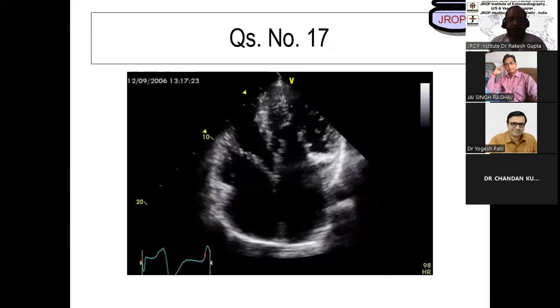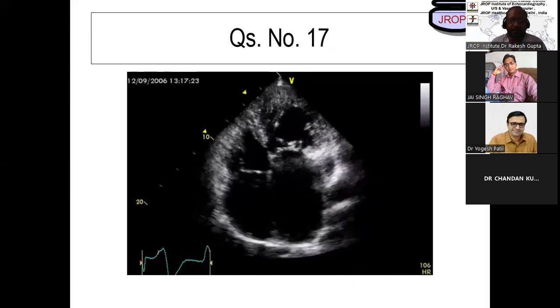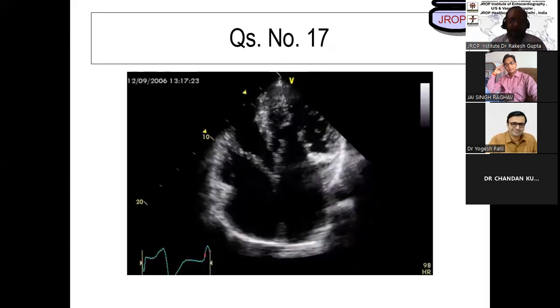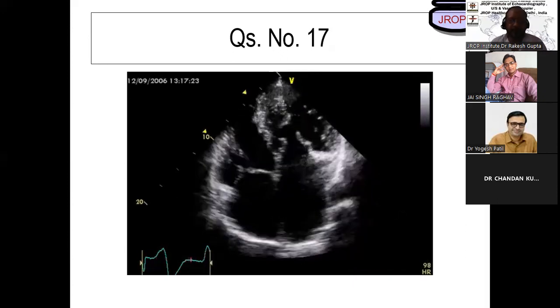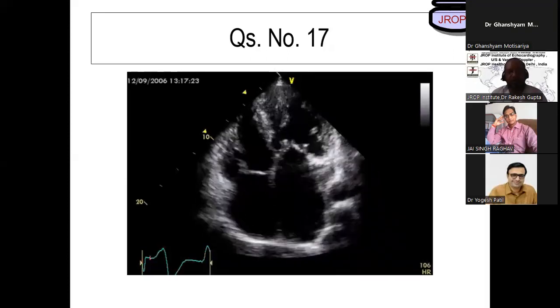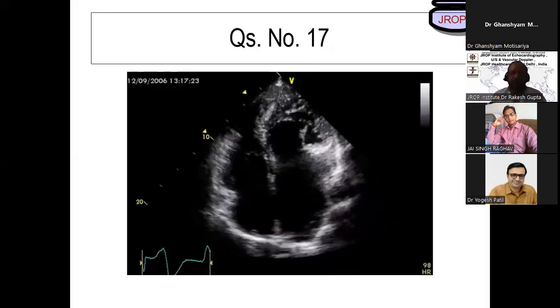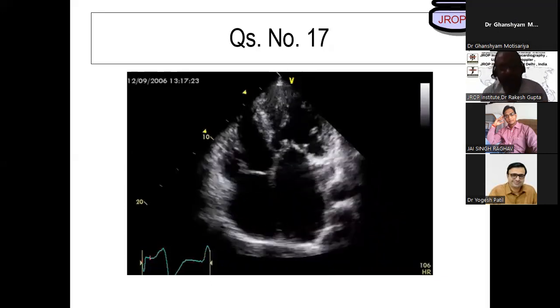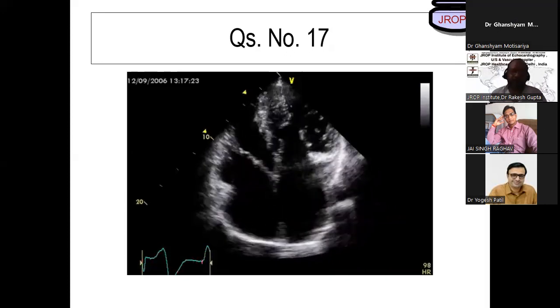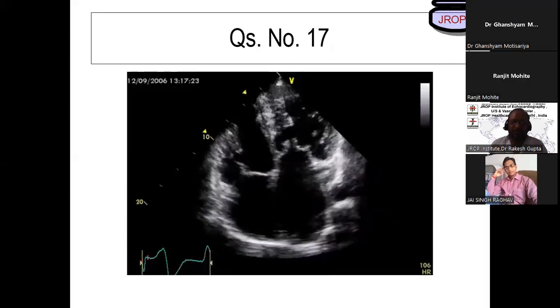Yes, sir. RA is dilated. LV is too much trabeculated. LA is also dilated. You are playing good hockey, man, but you have to win the match.